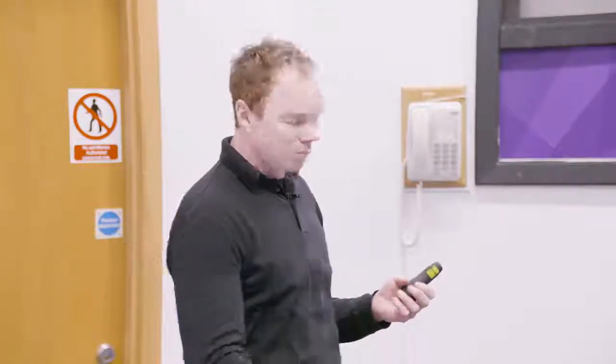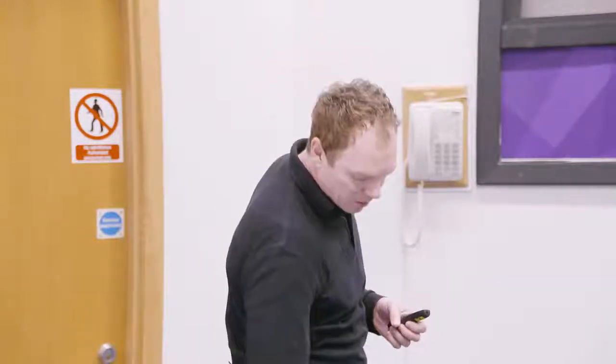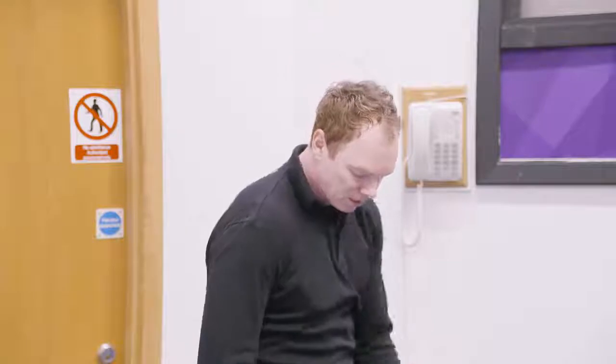In some cases the muscles react slightly differently than you would think. For example, when you're measuring the lateral quadriceps head here, in this case it's a big muscle. If you would look for the center, it would probably be somewhere around here, but it is covered by the iliotibial band, and also the other thing that happens during the contraction is that it doesn't form a belly in that direction. It actually moves away because it moves medially when the muscle is contracted. So these are the things that of course need to be taken into account when positioning.